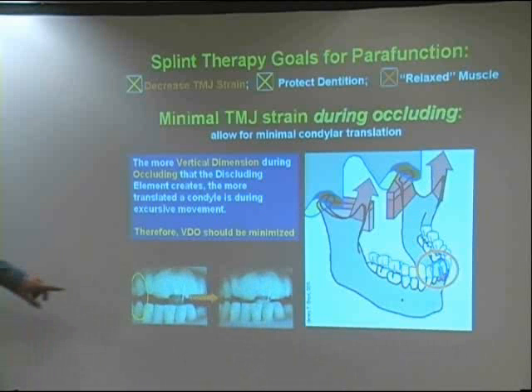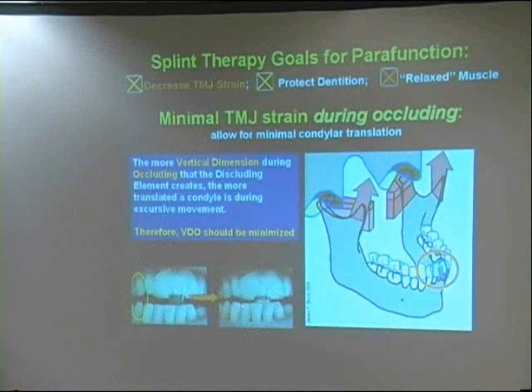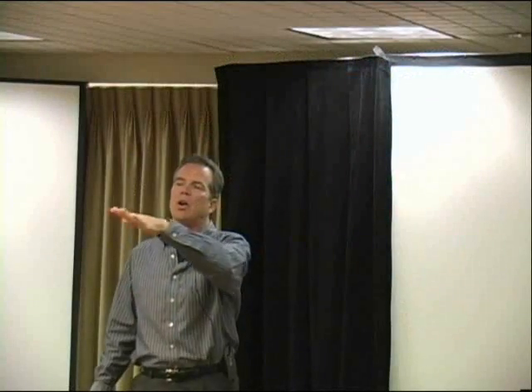So if this patient here said, my jaw is kind of sore now, you put the device in and you have them go to the side and squeeze, nothing's touching, and they kind of go, oh yeah. And so you shave down the discluding element, you close the vertical dimension as much as you can so there's daylight between these potential contacts. That same person at that same visit will squeeze with the device and it won't hurt them. I want daylight disclusion in all excursions or protrusions.